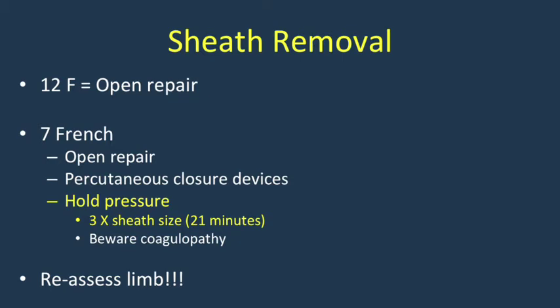Once distal perfusion has been confirmed, the 7 French access affords a variety of options for subsequent closure. Open repair — which was required for the 12 French access utilized with CODA — is a perfectly acceptable option, as are a variety of percutaneous closure devices commonly used in vascular surgery and interventional radiology. Alternatively, you can simply hold pressure, which is one of the attractive elements of ER REBOA utilization.